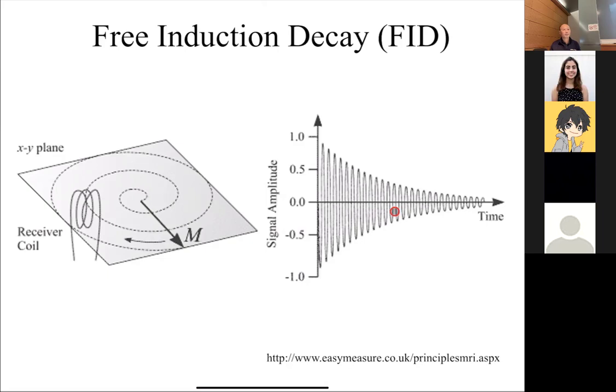Yes. Polarization and excitation only affect hydrogen, or other nuclei? That's a great question. The question is, am I affecting other protons? There's two things. For example, the hydrogen proton's resonance frequency actually depends on its local environment. So not all hydrogen protons have the same resonance frequency. Hydrogen in fat will have a different resonance frequency than hydrogen in muscle and brain.